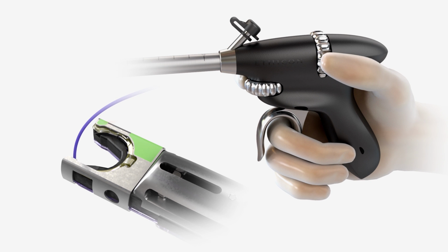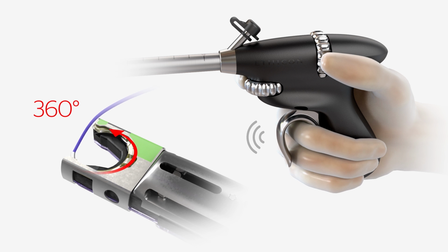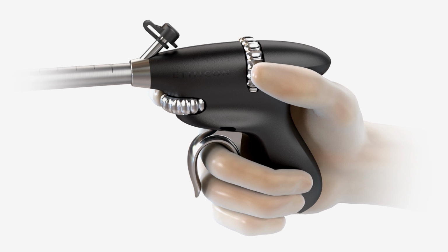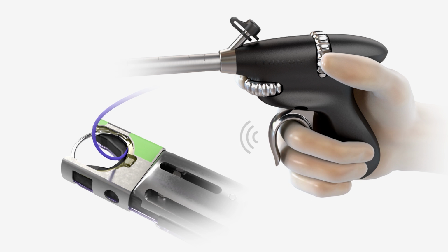Fully squeeze the trigger until it touches the handle once to rotate 180 degrees, then a second time to complete the 360-degree cycle. If the trigger is partially squeezed, the trigger will remain in the partially squeezed position. To return the trigger to its original position, fully squeeze the trigger until it touches the handle. Be aware the needle exits from the green side of the cartridge. If the needle does not rotate freely or return to the home position, repeat the test.